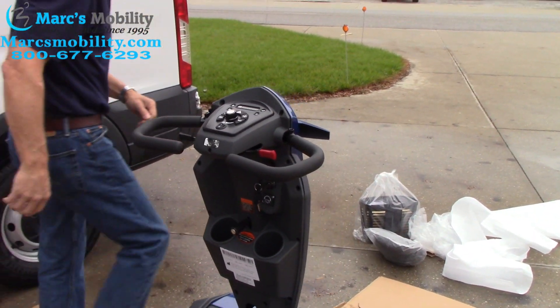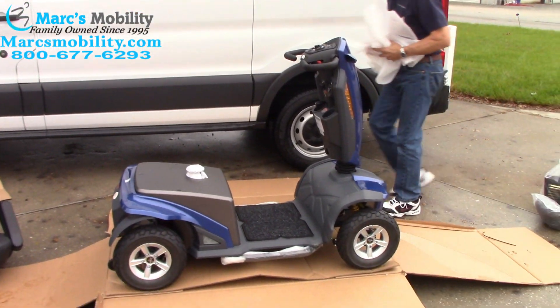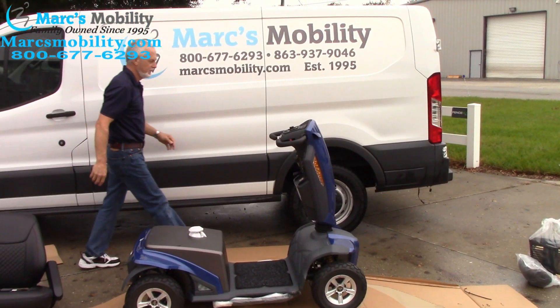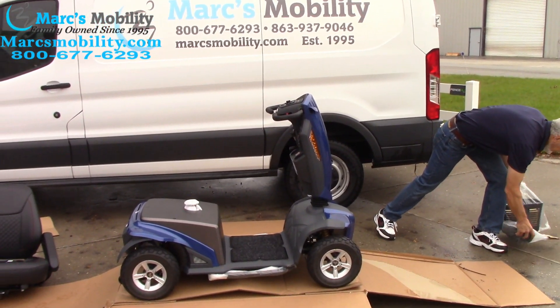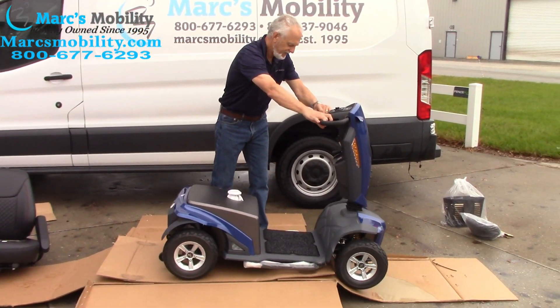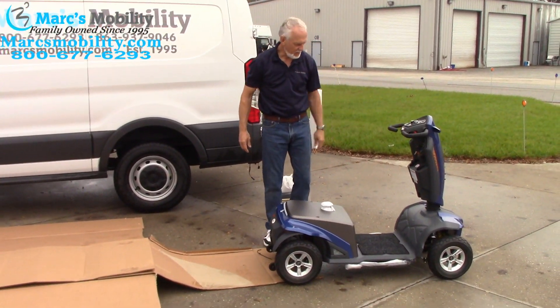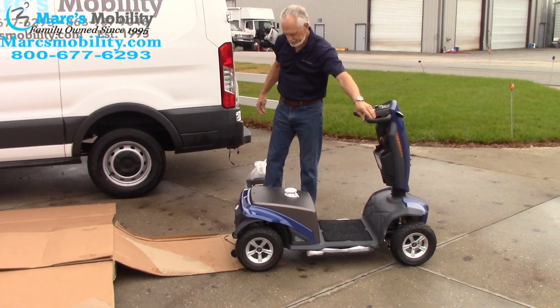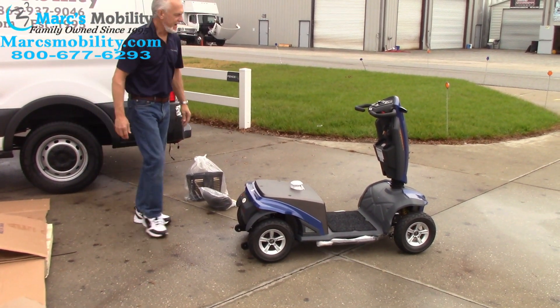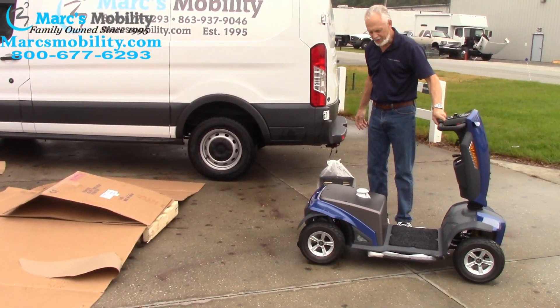I'm going to move this garbage out of the way, put the garbage with the garbage. I'm going to take the headrest and move this back. Now I'm going to see if the scooter will go forward off the pallet on its own — and it does. We've got the scooter off the pallet on its own. I'm going to back it up a little bit so you can see it. So you do have a reverse.